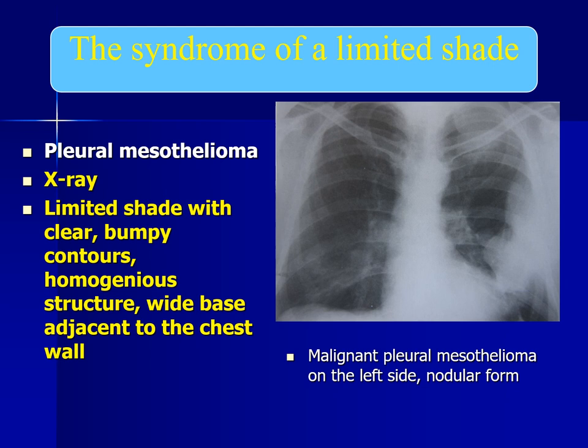A patient with encapsulated pleurisy shows a shade of semispherical or semi-oval shape with a wide base merging with the chest wall, homogeneous structure, and clear contours. The pulmonary pattern in adjacent sections is thickened due to compression and convergence of vascular branches. Another example is pleural mesothelioma: a limited shade with clear bumpy contours, homogeneous structure, and a wide base adjacent to the chest wall — malignant pleural mesothelioma on the left side, nodular form.